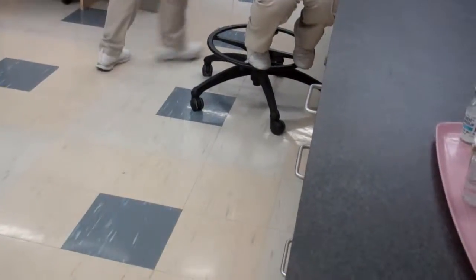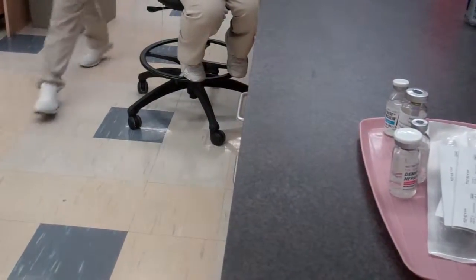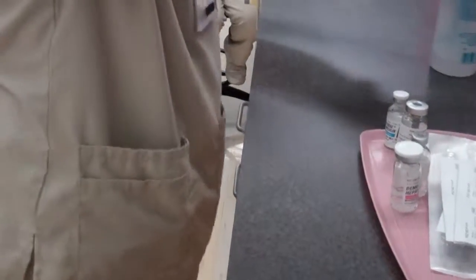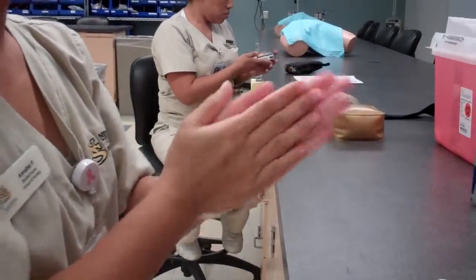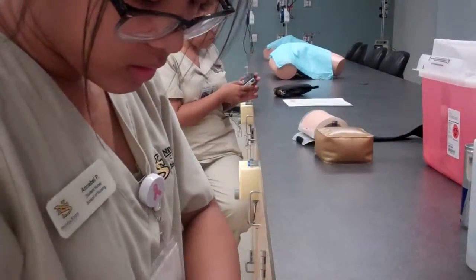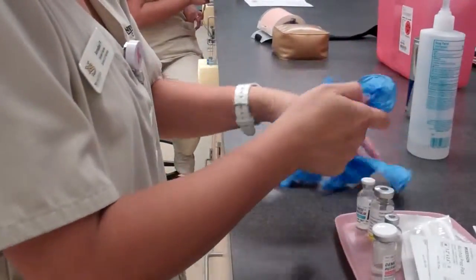Okay. So I'm going to wash my hands. Wash my hands for 30 seconds. 1, 2, 30. I'm going to apply my gloves.